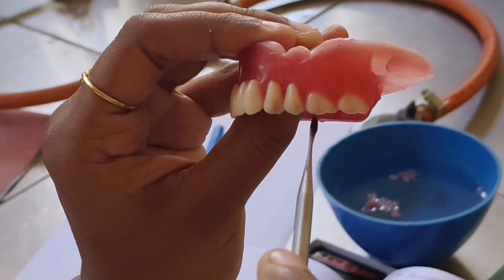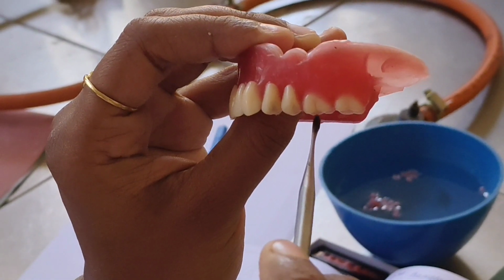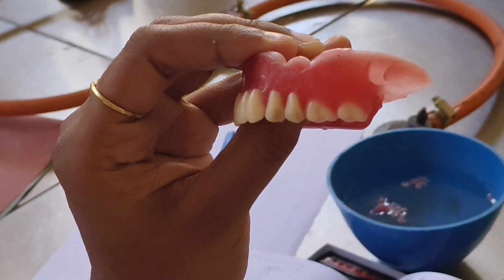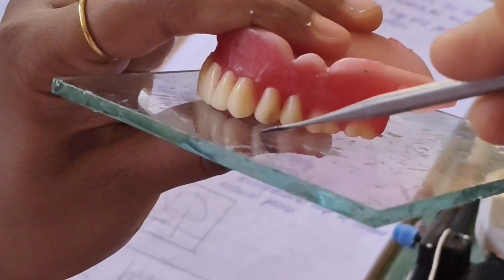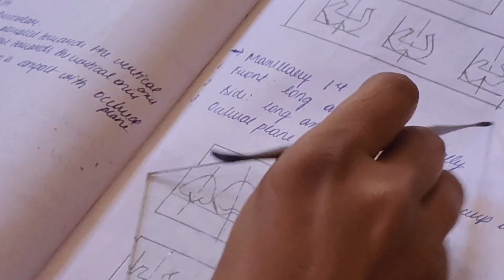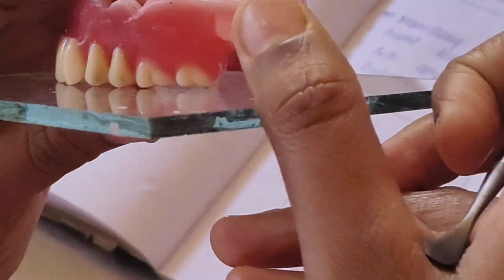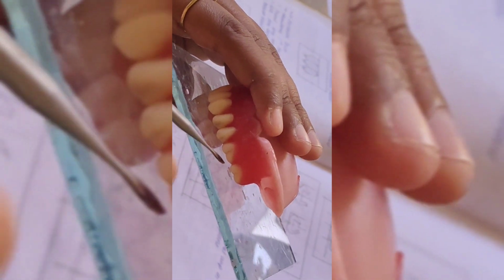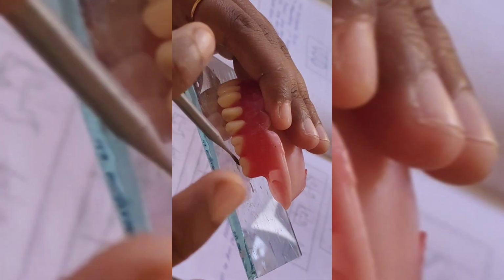In palatal also, the mesiopalatal will touch the glass plate. The second molar will be the same as the first molar, but nothing will touch the glass plate. Showing the relation on the glass plate, very carefully we can see the mesiopalatal is touching. The second molar is the same but nothing is touching.